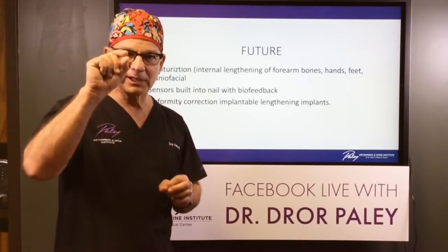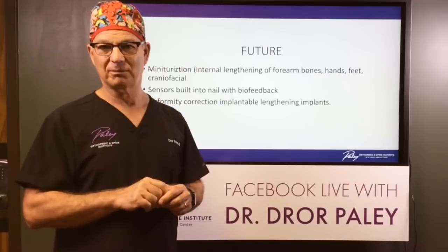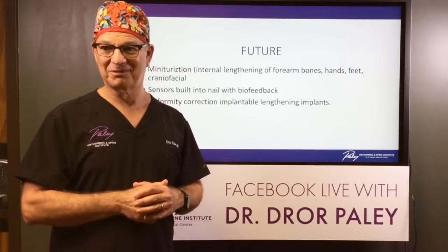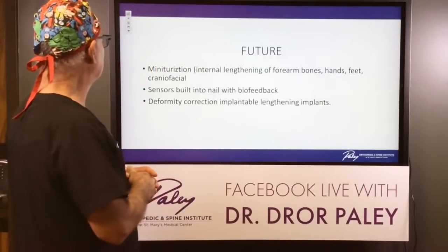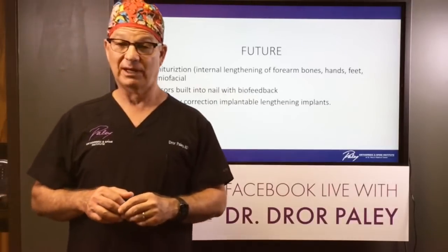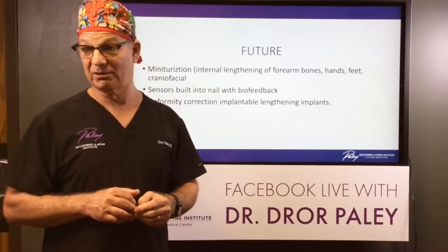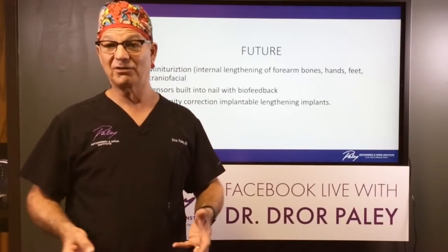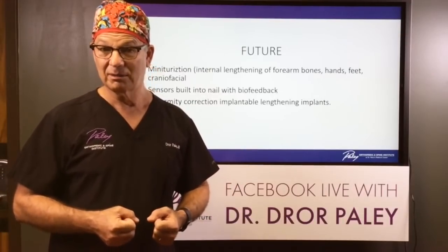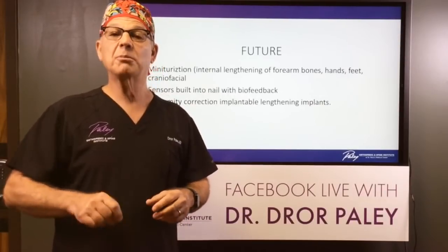In fact, we may eventually make a biofeedback loop, just like the thermostat in your room. You set it to 70 degrees, it stays 70 degrees, right? It turns on and off the heat pump when you need it. Same thing here. We're going to set it that we never want to see the tension in the system get higher than this, and it will lengthen at that rate to make sure that the tension stays low, so you're going to have fewer problems with muscles, with joints, with nerves, with blood vessels, with skin, stretch marks, and so on.